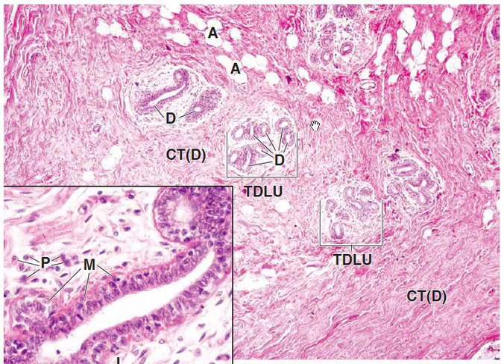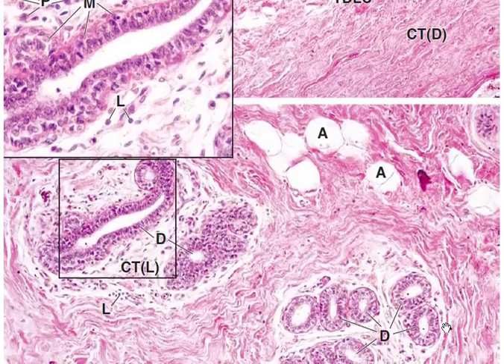Beyond the lobular unit, the connective tissue is more dense. So out here it's more dense compared to, say, around here. All right. Now, let's take a look at this next picture.